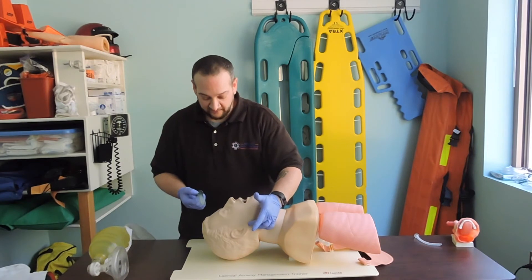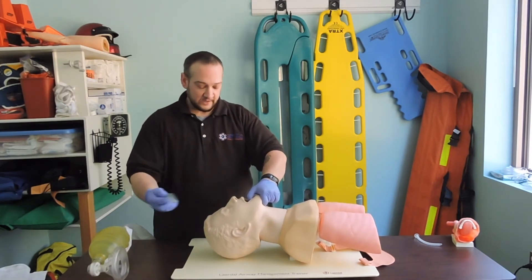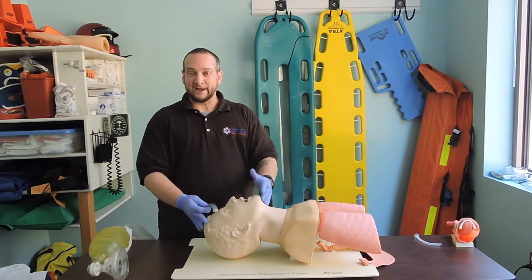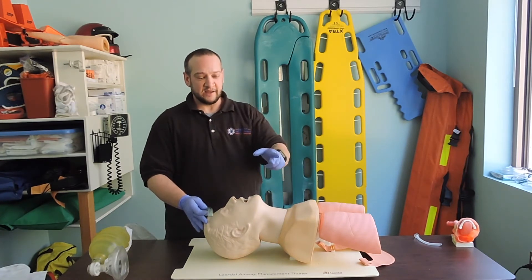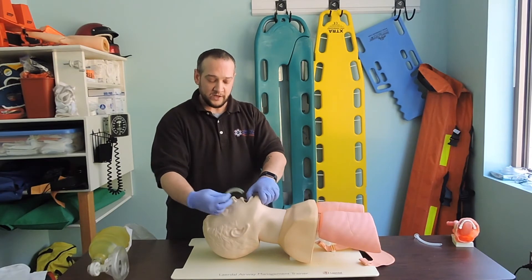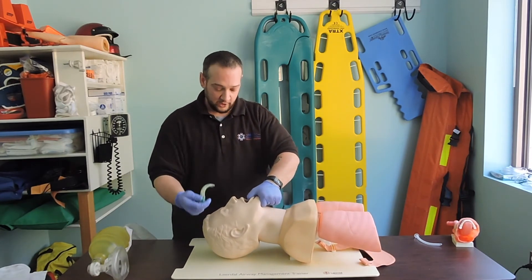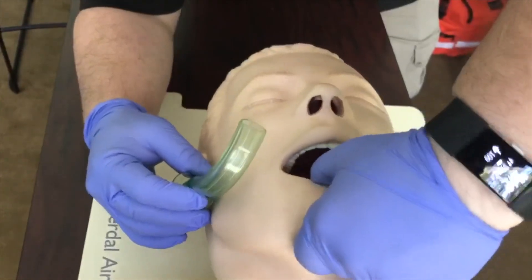Now that we have the appropriate size — measured from tip of ear to corner of mouth — I'm going to do a tongue jaw lift to insert it. In your book, you'll see the scissor technique where crossing fingers spread to open the airway; personally, I don't prefer that due to rubbing against the teeth. I prefer the tongue jaw lift. Always have the OPA ready as a biting block so if the patient convulses, they don't bite off your thumb. I've got a good hold and I'm coming in at 90 degrees.